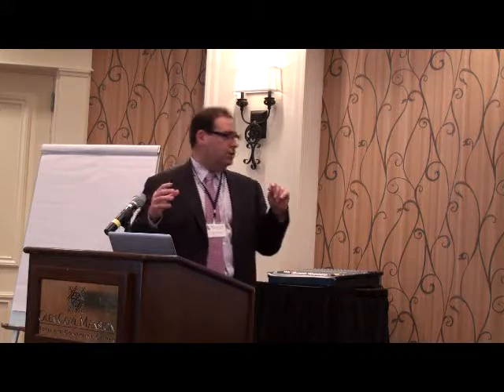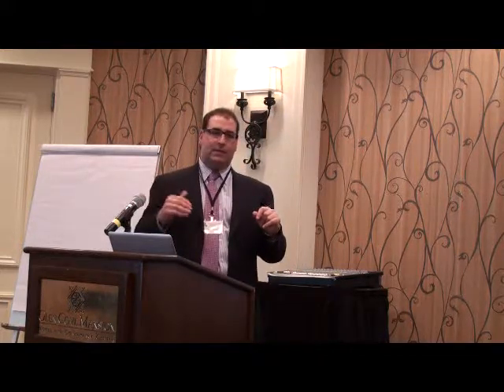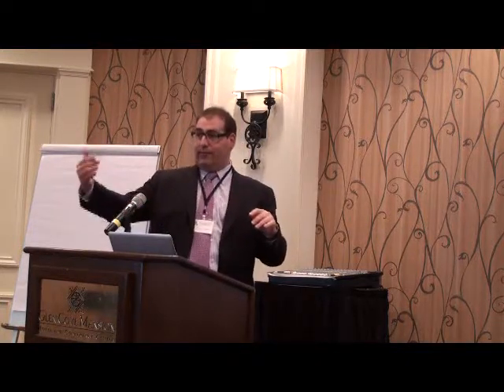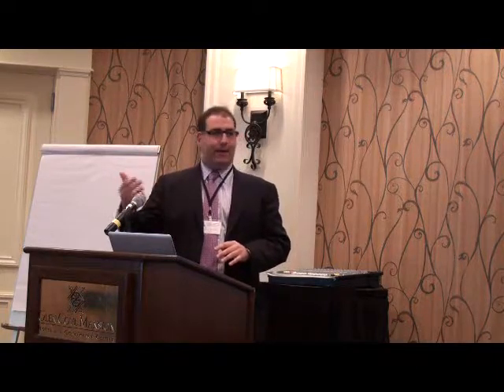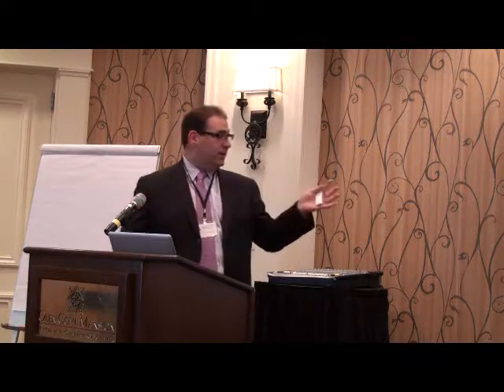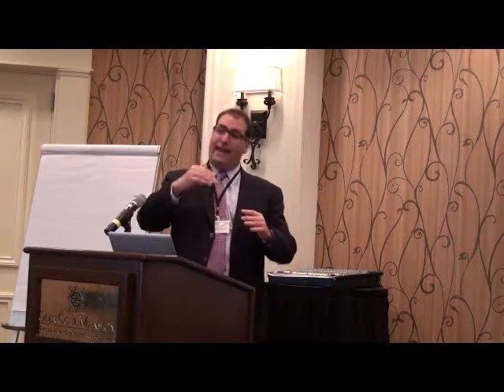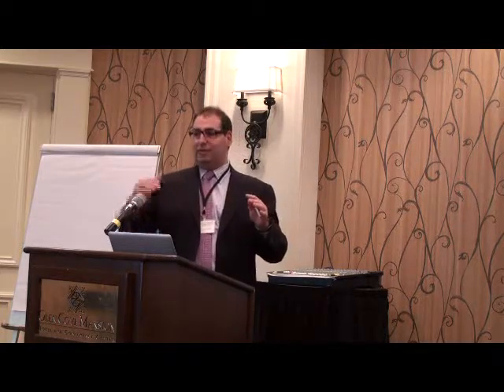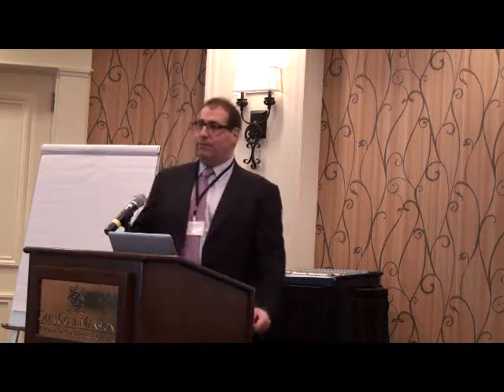In very large tumors, we have learned that if you embolize those, particularly very large solitary tumors, the risk of infection and abscess formation goes up and could make things worse. But because we can be super selective now with catheters, we could potentially embolize even very large tumors in a staged fashion and try to minimize the risk of those complications.